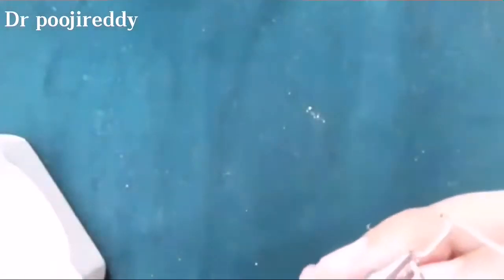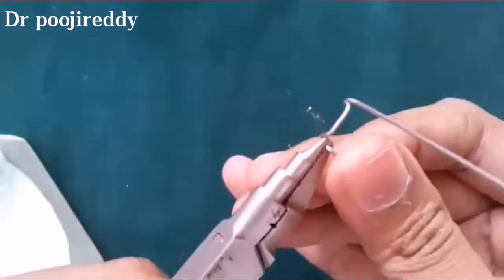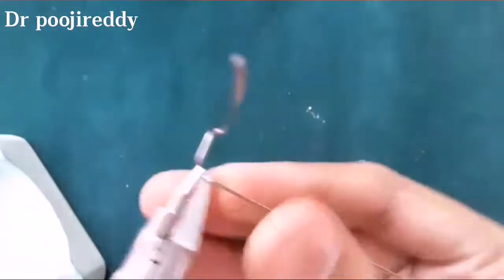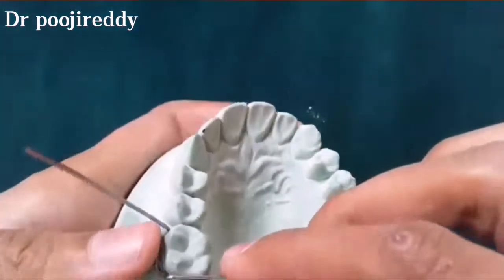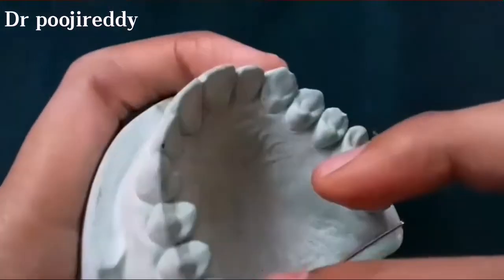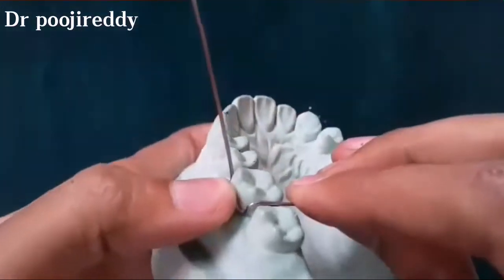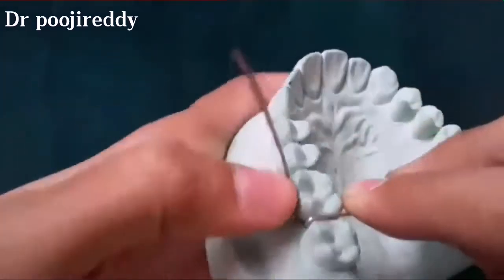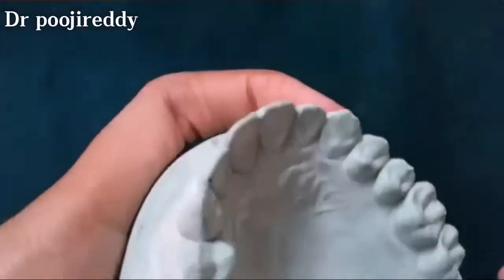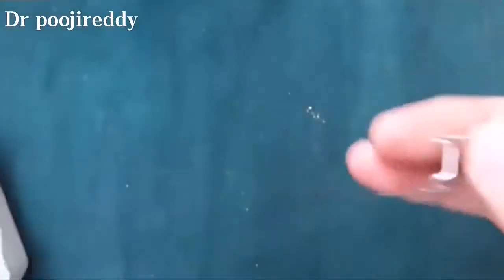Do not bend at a time. Check for adaptation and give a slight bend till the clasp will perfectly adapt to the tooth surface. See, now we got the 45 degree angulation, which is very important for the Adams clasp fabrication.